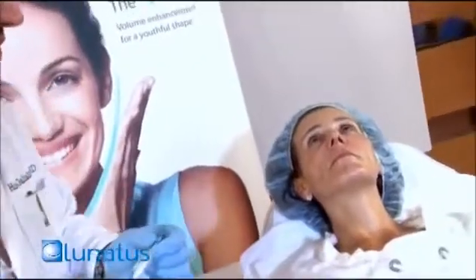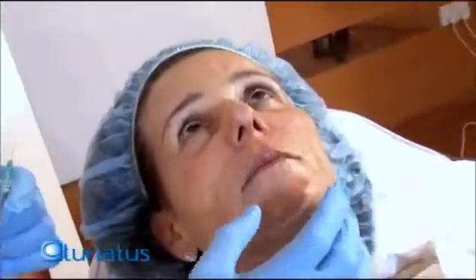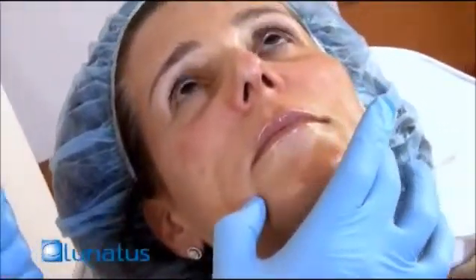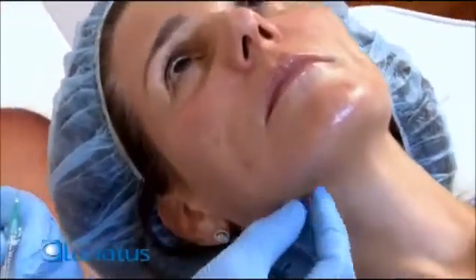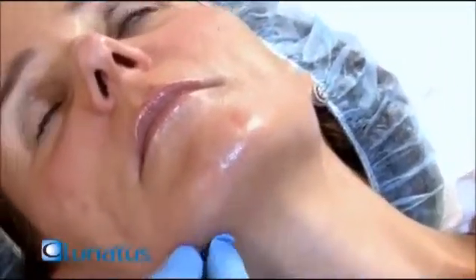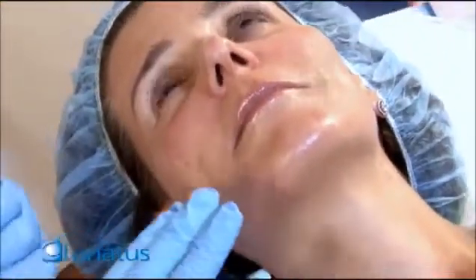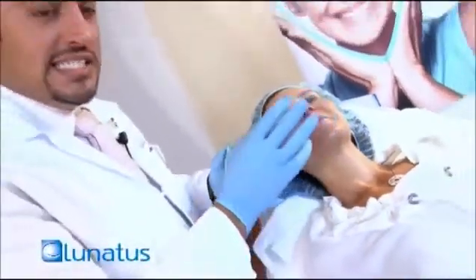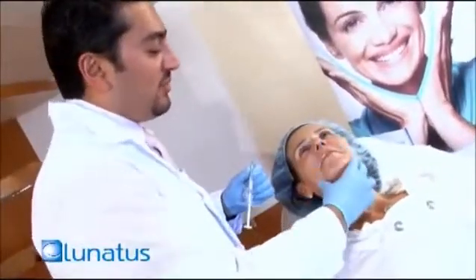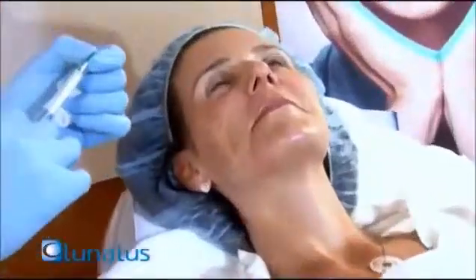For Roberta today, we're going to be injecting a little bit of the nasolabial folds. Anytime you inject the nasolabial folds you also have to tackle the marionette line, so those areas also need to be injected. Plus she has a very minimal pre-jowl defect going on here. We're going to sculpt and make it sharper. She's had this done before using calcium hydroxylapatite and we're going to do the exact same thing — touch it up a little more — which will provide her with a great cosmetic effect.